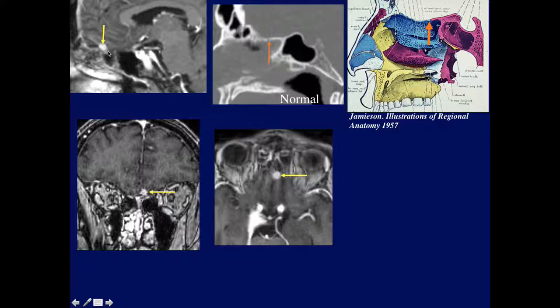Here's the smallest lesion I have — only about 7 millimeters. Notice it's right at the sphenoethmoidal suture junction. This is where these lesions start. And here it is on the axial — just below the gyrus recti, a very tiny lesion.